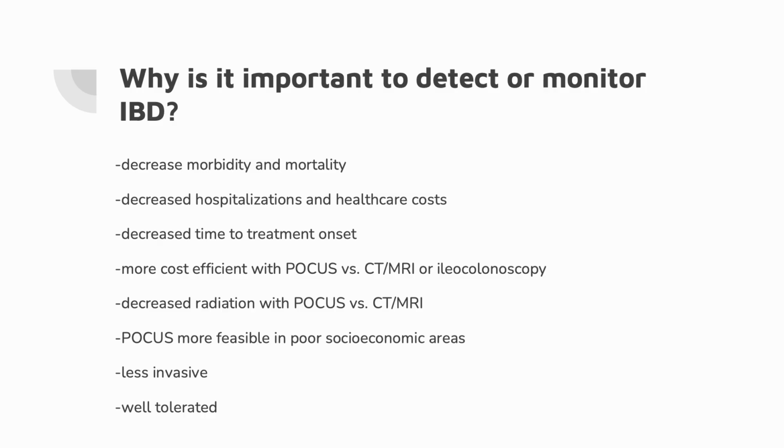POCUS is also more feasible in poor socioeconomic areas. Ultrasound is often more accessible than a big, bulky CT machine. And obviously, ultrasound is less invasive. It can be done at the bedside and is very well tolerated by our patients.